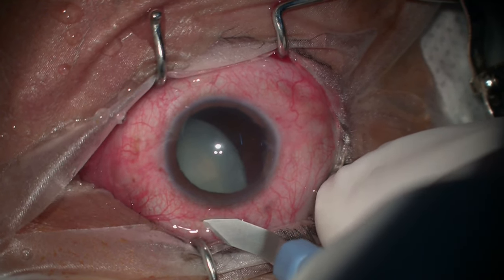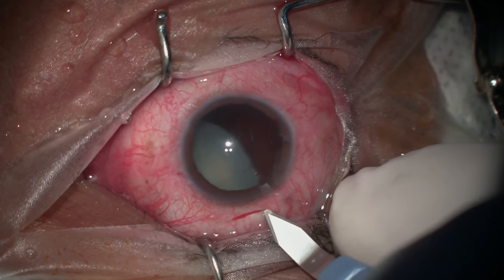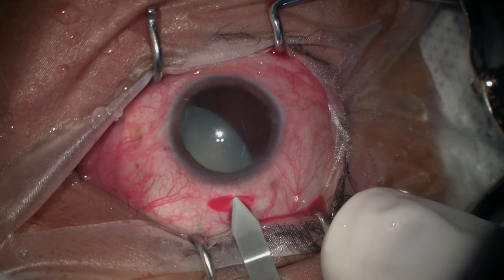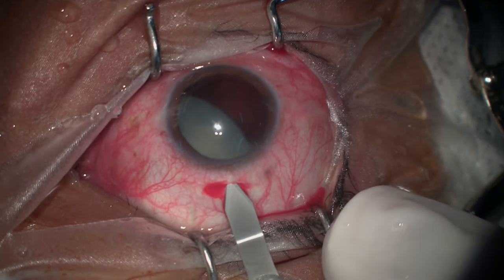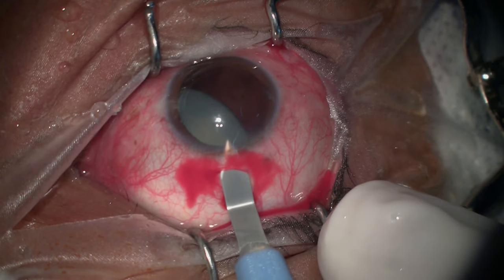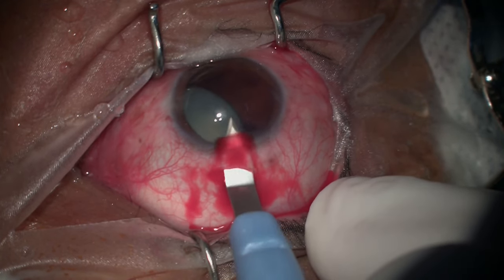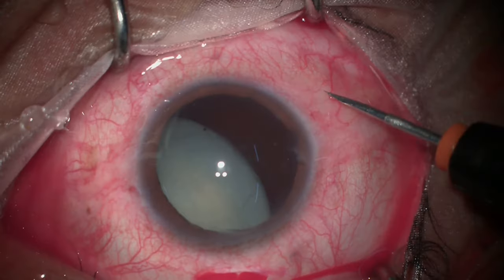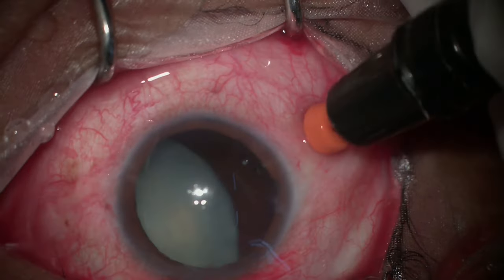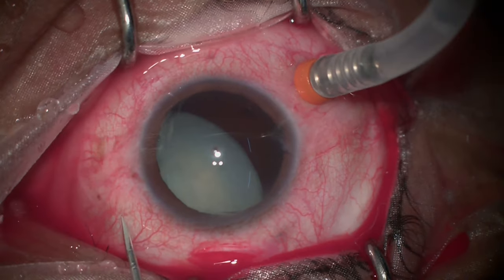One serious complication after sustaining trauma to the eyeball is dislocation of the crystalline lens. Today we'll see a case in which a 40-year-old male sustained trauma and had a dislocation of the crystalline lens.